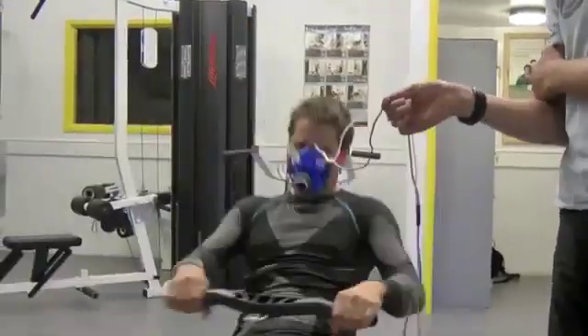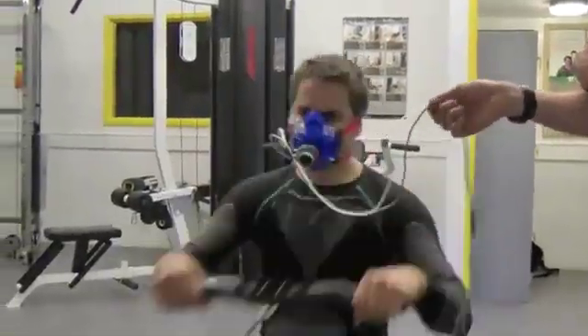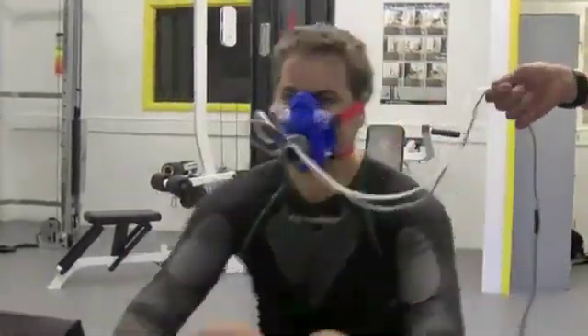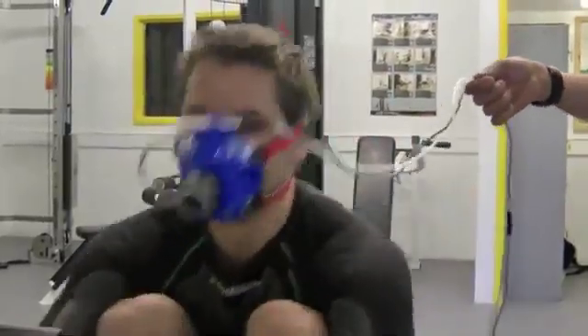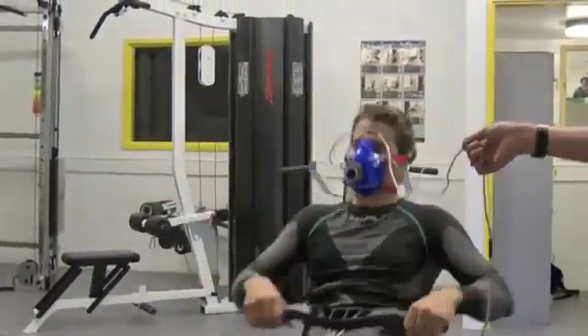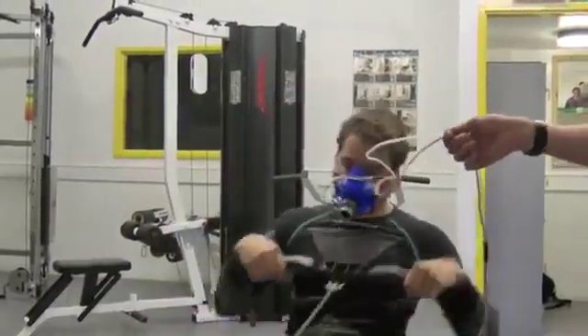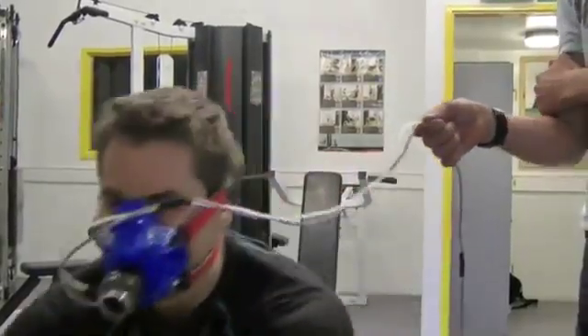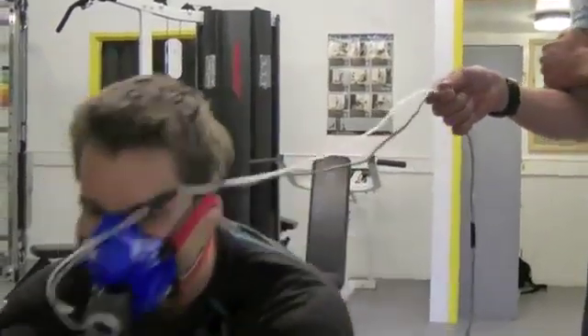Keep going, really hard. Harder, harder — you've got more in you, I can see it. Keep going, Marion. Come on now, this is it. Another 10 seconds on the 30. Come on, you can do it. Push it out. Keep going. 10 more seconds. Come on, Marion, you can do it. Keep going. Come on — that's it. Okay, you're at it now. Good.